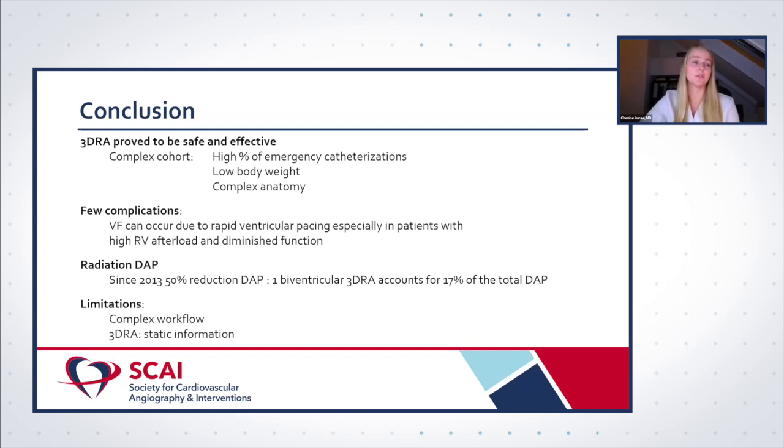There are considerable limitations to the usage of 3DRA. First of all, the workflow of performing and post-processing high-quality 3DRAs is complex, and it involves cooperation and good knowledge of the entire team, and working together in a manner that is good for everyone.